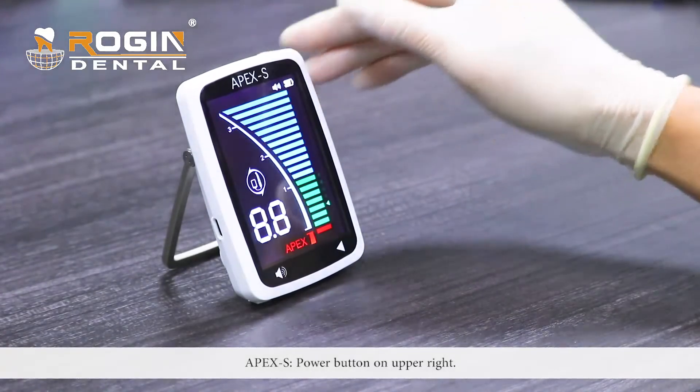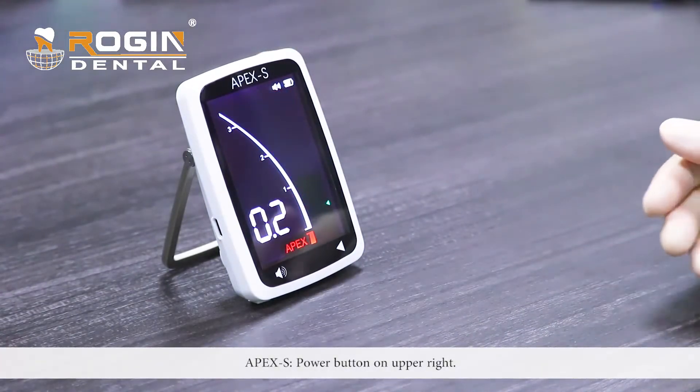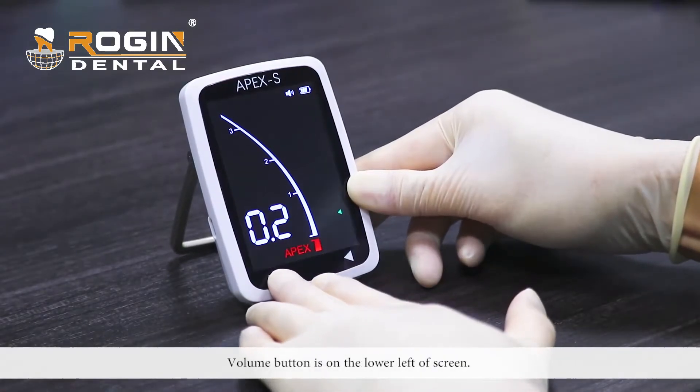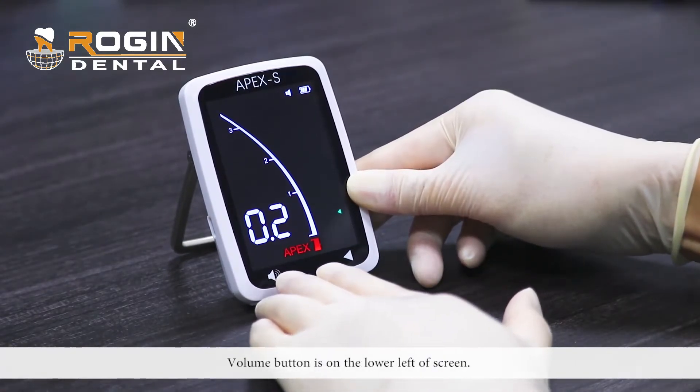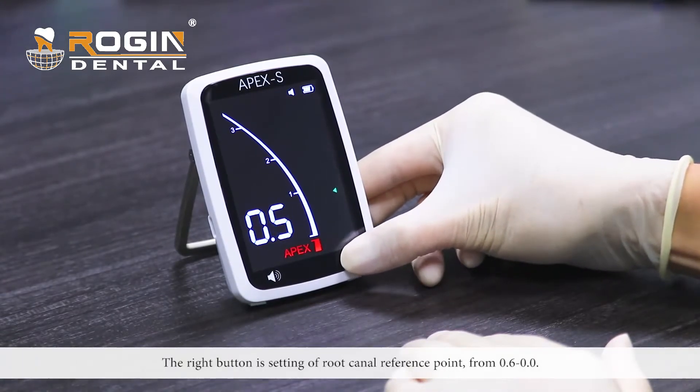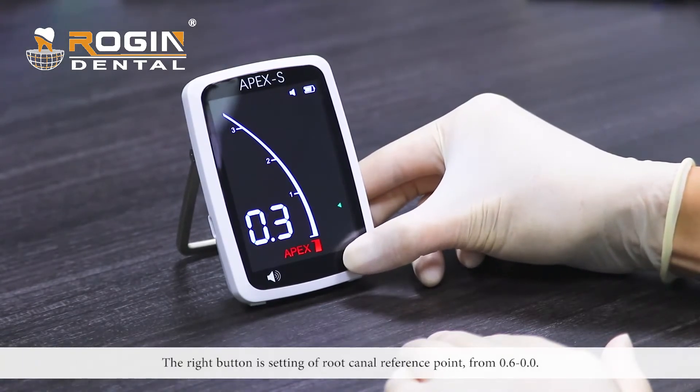On the Apex S, the power button is on the upper right. The volume button is on the lower left of the screen. The right button is for setting a root canal reference point, from 0.6 to 0.0.